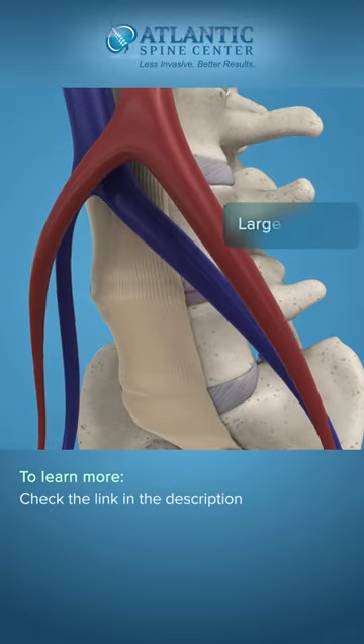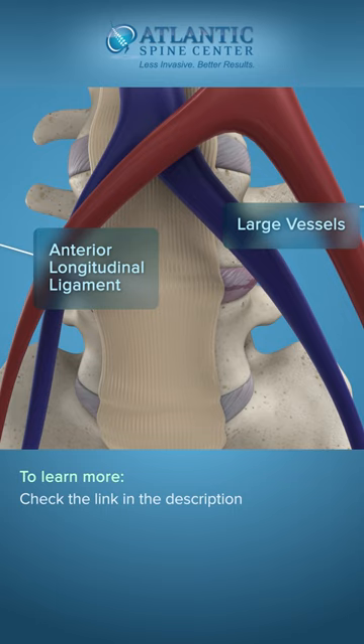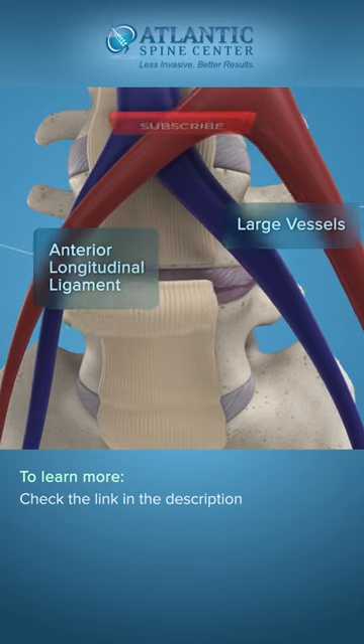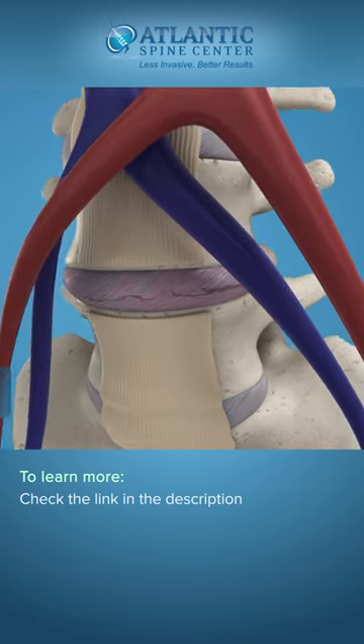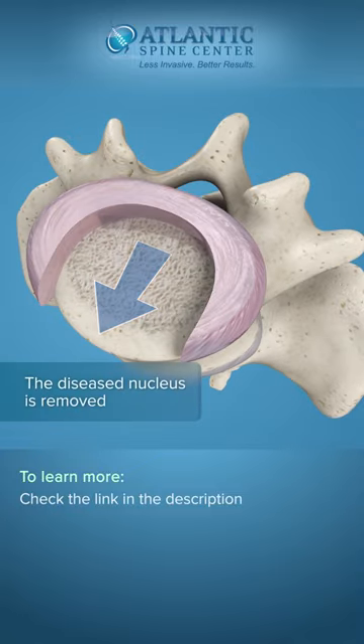The surgeon works around the large vessels to access the anterior longitudinal ligament. The ligament must be removed to access the disc. The surgeon can then remove the diseased disc nucleus to prepare the vertebral bodies for fusion.